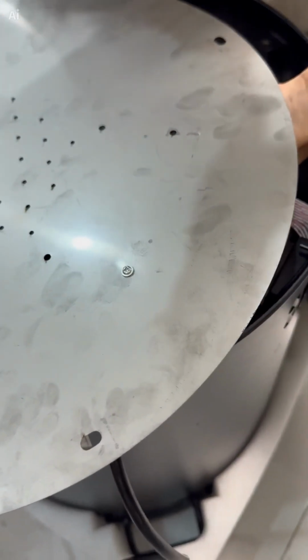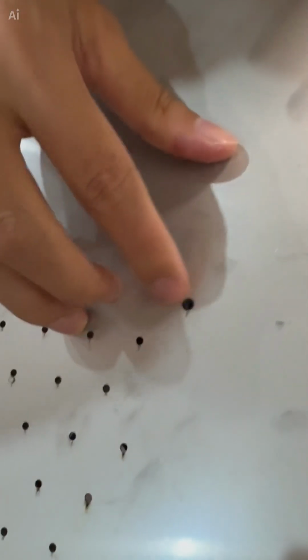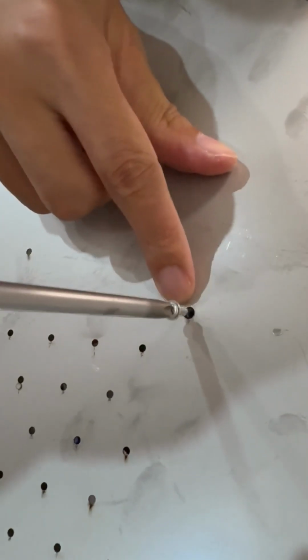Okay, now we film here. Okay, we just locked one hole, then start locking a diagonal hole, lock the diagonal hole, then find the diagonal position and lock it in.